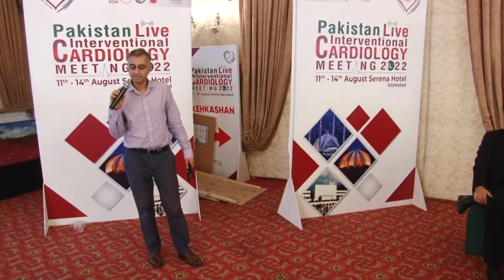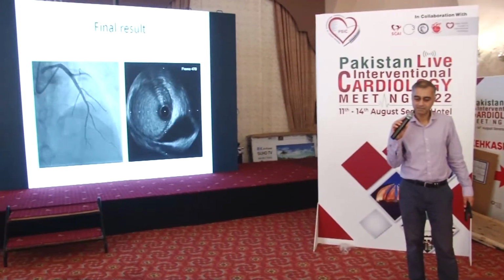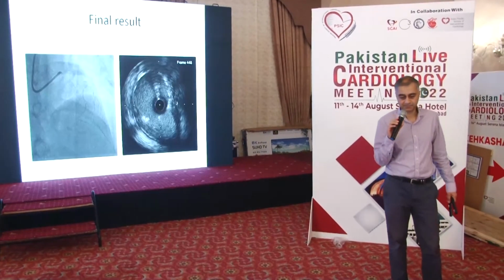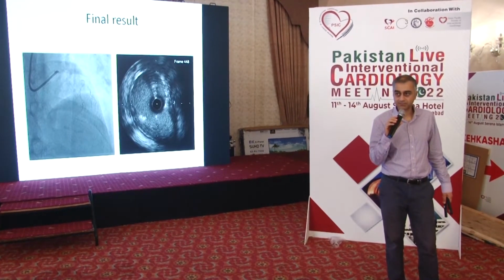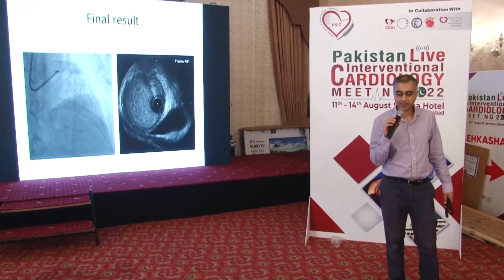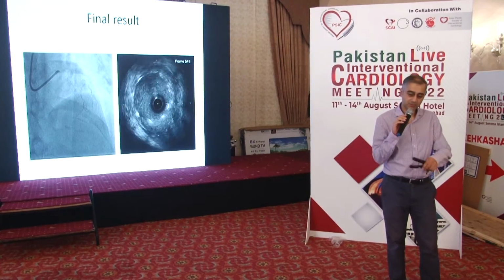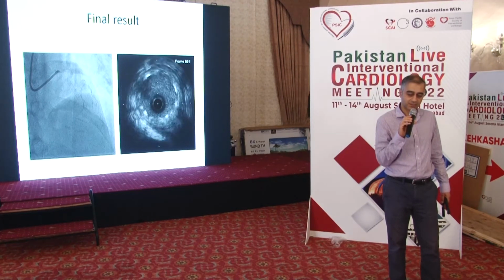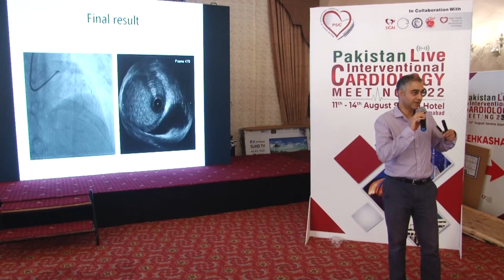Can I have the next slide, please? Okay, so this was the result after the 6mm balloon. So if you look at the IVUS, of course you're not going to get rid of the plaque.